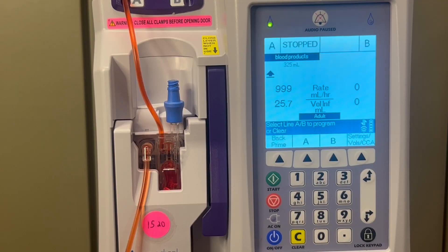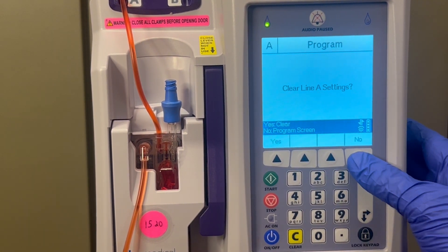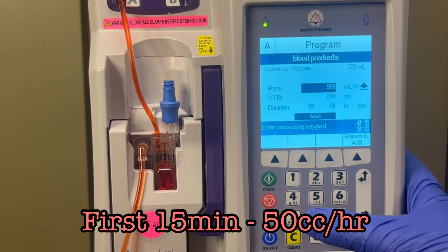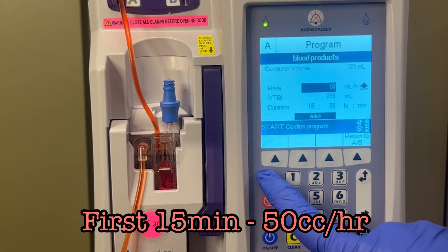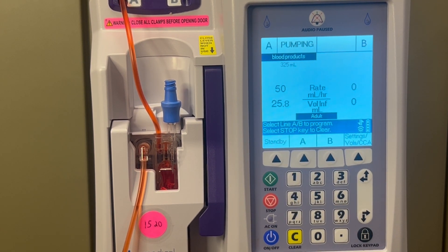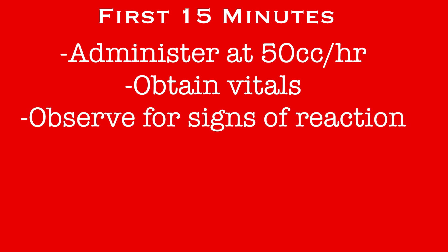Return to the pump to continue the program. Choose the A line again and don't clear the settings already entered — just edit them. For the first 15 minutes of any transfusion, the blood will be administered at the slow rate of 50 cc's per hour. So change the rate from 999 to 50 and push start. As soon as you start the blood, get a new set of vitals on the patient and document them in EPIC. During this initial 15 minutes, the nurse will remain in the room at the bedside, observing the patient for any signs of reaction to the blood product.